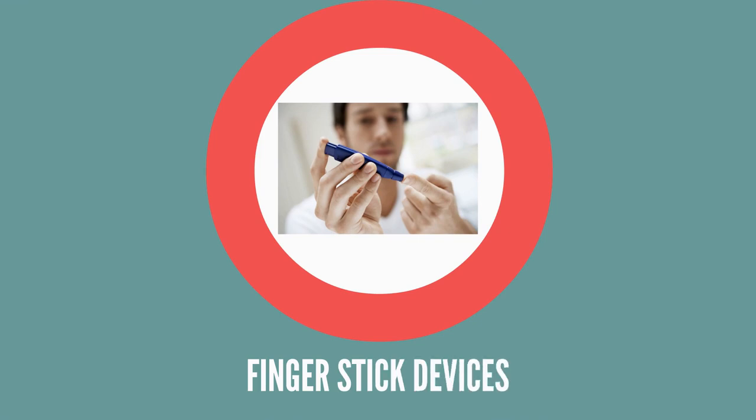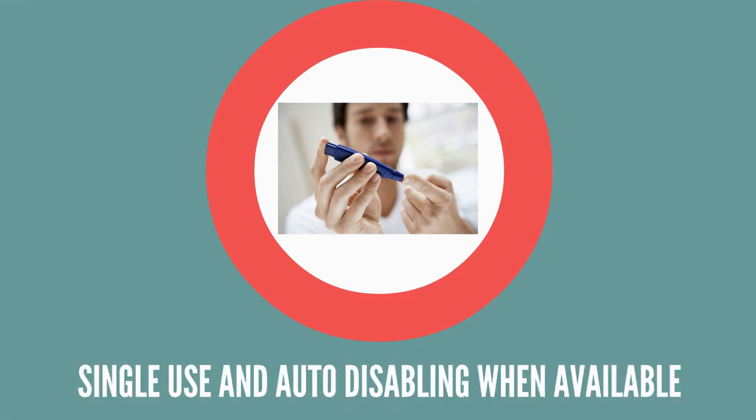Fingerstick devices should never be used for more than one person. Use fingerstick devices which are single-use and auto-disabling. This makes them the safest choice for both the individual being tested and the worker assisting them.